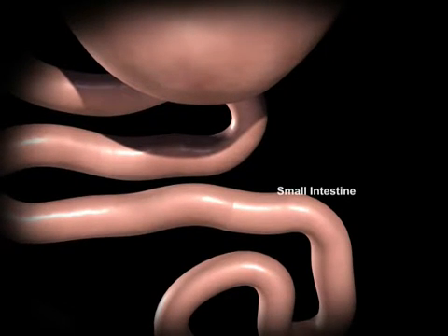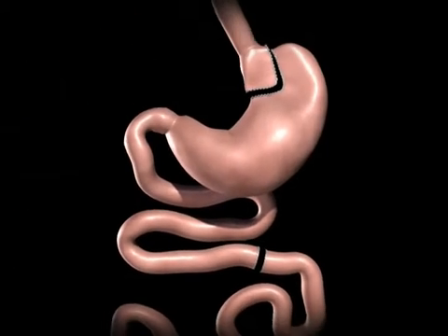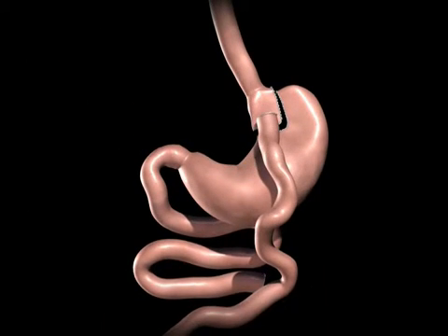The small intestine is separated into two sections. The lower portion of the small intestine is attached to the newly created stomach pouch. This allows food to pass directly into the small intestine, where digestion continues.